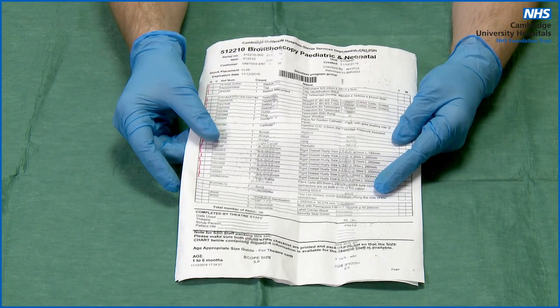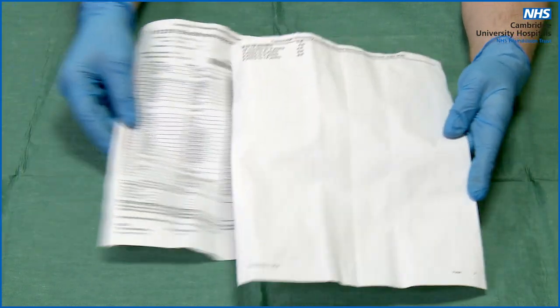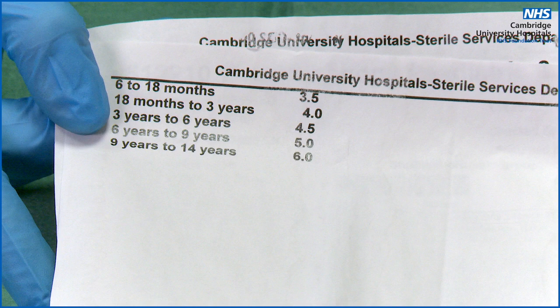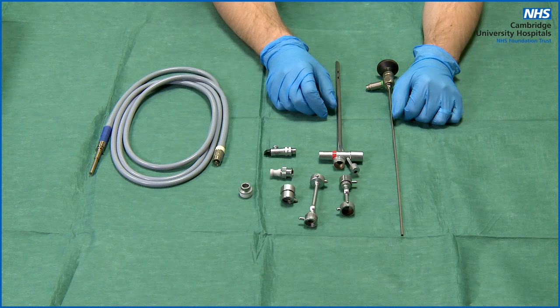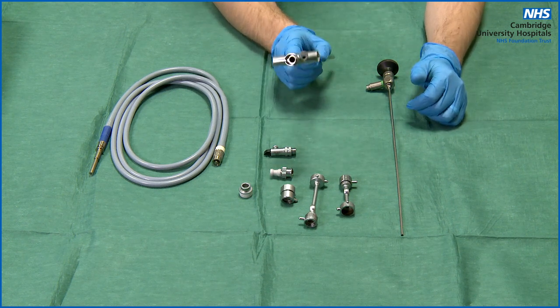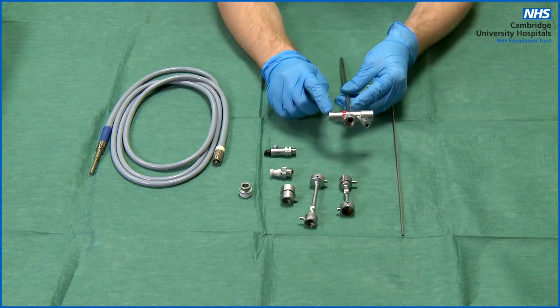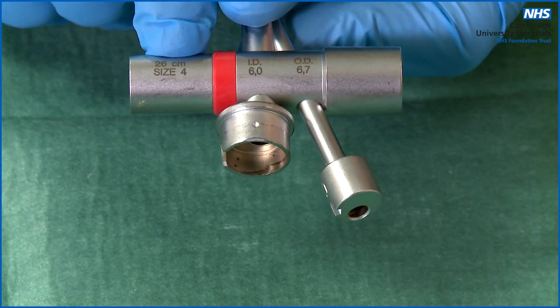At CUH, written at the bottom of the instrument checklist that comes with every set, you will find a chart showing which bronchoscope you will need for your patient based on their age. The chart goes from 0 to 14 years old. With foreign body aspiration, the child is often aged between 2 to 3 years old, so in this video I will be demonstrating how to set up a size 4 bronchoscope.